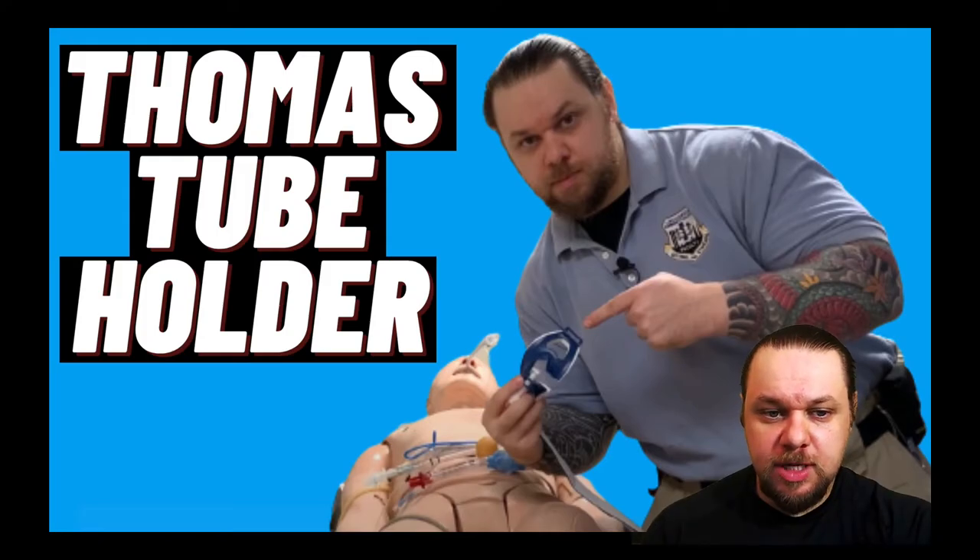I've seen far too many videos of the Thomas tube holder placed upside down, and a lot of instructors demonstrating the wrong technique with securing this device. In this video, I'd like to show you how to place the Thomas tube holder properly, utilizing the manufacturer's guidelines.